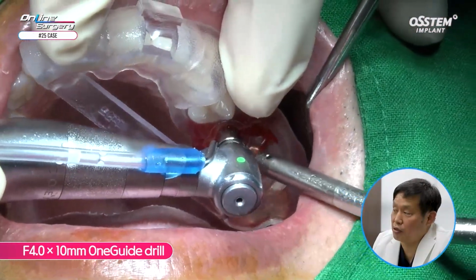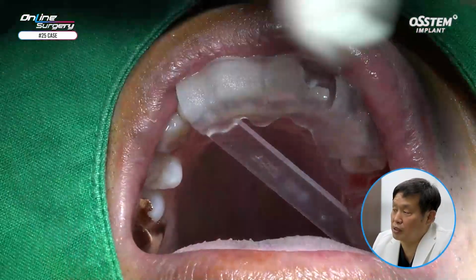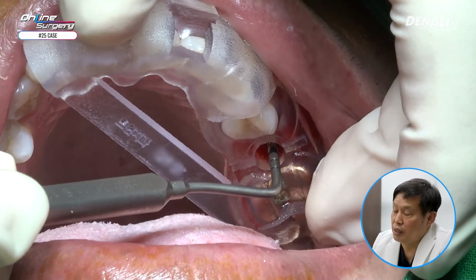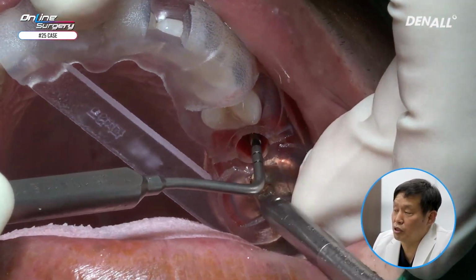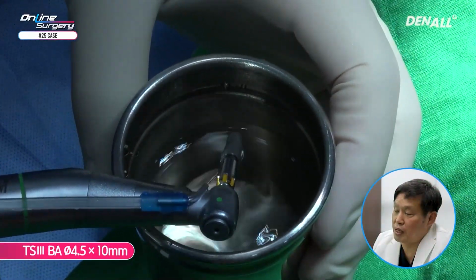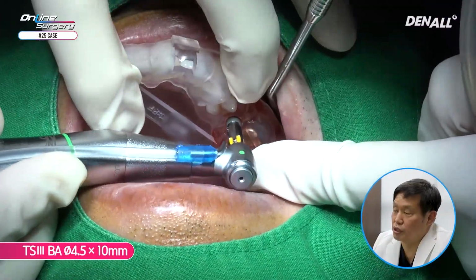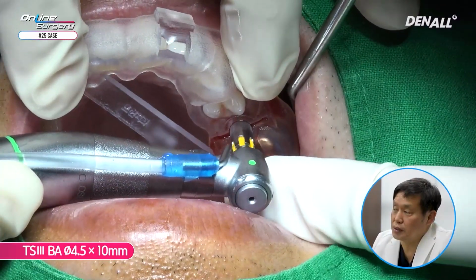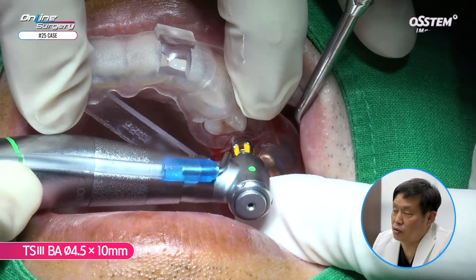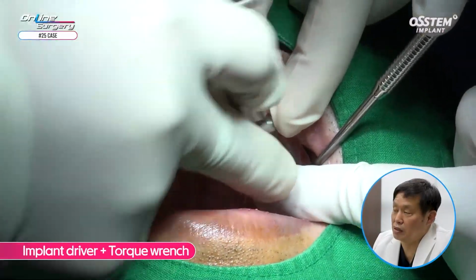A 4.0 by 10 mm one guide drill is used as the final drill. It's an extraction socket, therefore, for primary stability, the 4.0 by 10 mm one guide drill is used. Once again, I'm checking whether the sinus floor is penetrated. I can sense something on the apex site, but that's not going to be a problem. The TS3 BA 4.5 by 10 mm implant is sufficiently irrigated, and now I'm positioning the implant. With the engine, the implant is placed 80% because under-drilling is done. The primary stability is more favorable.